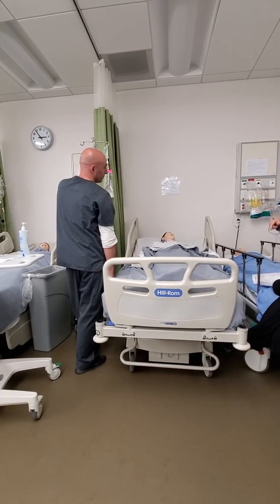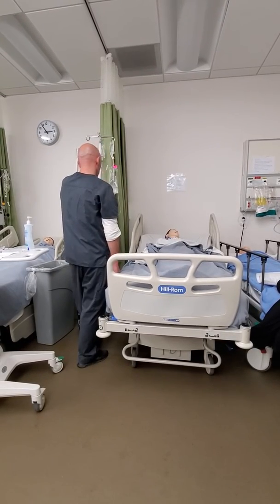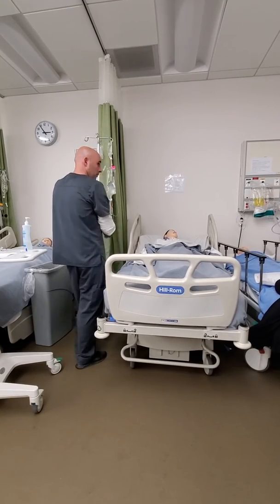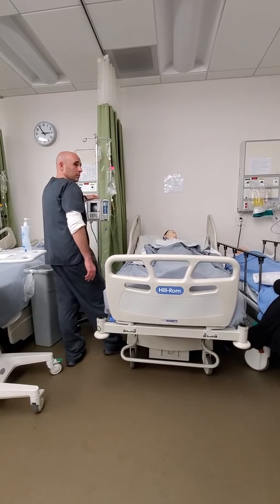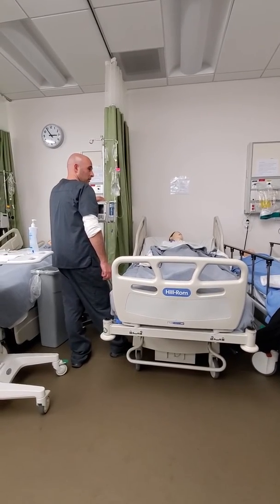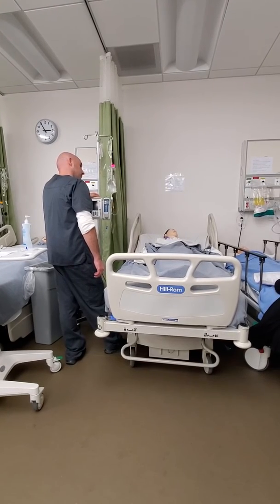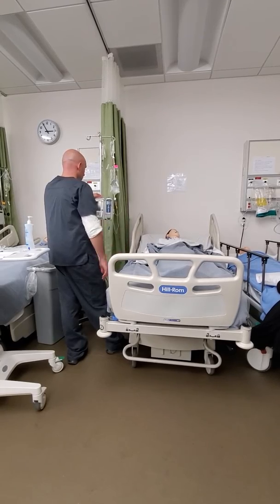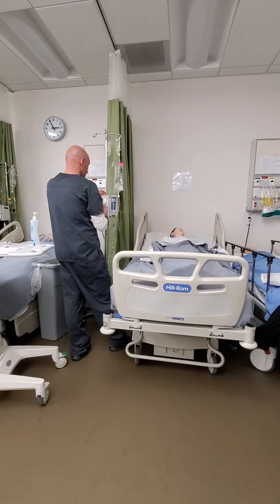Because once the secondary's done, your primary will kick in. Okay, so all I do is program the primary as TKO. What would be the keep vein open rate? I don't know. 10 to 20. 10 to 20 an hour? 20 for central. It can be 10 to 20 for peripheral, but 20 for central. Okay, so I just always remember 20. Just do 20 either way, you're safe, peripheral or central. Okay, so I would program the primary line to 20 milliliters an hour.